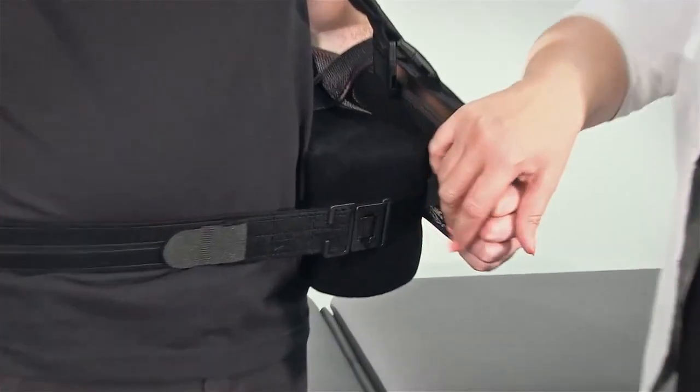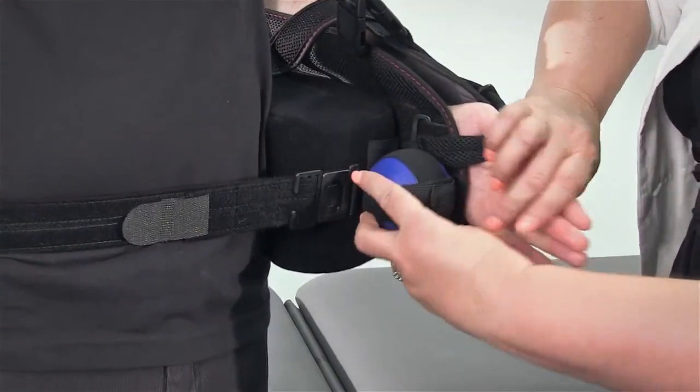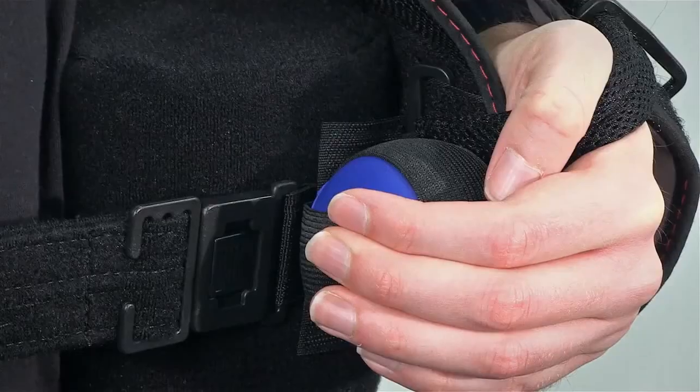The exercise ball, which is used to aid in stimulating circulation, can now be attached, if not in place already.